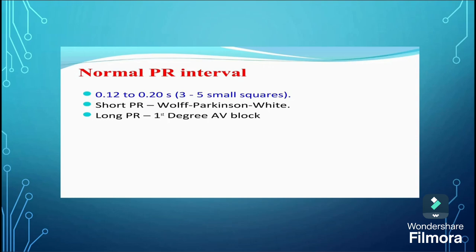So you should know the importance of PR interval, in which condition the PR interval is short, and what is the normal duration of PR interval.